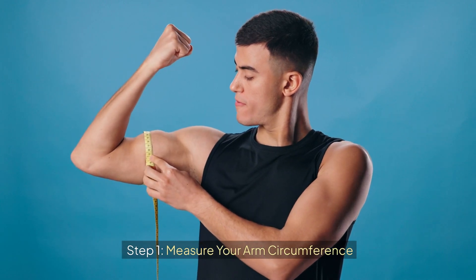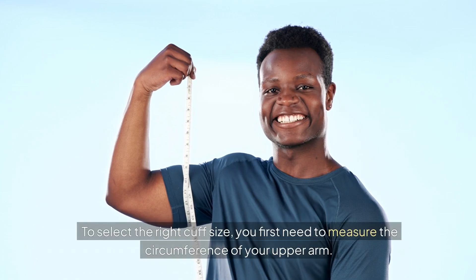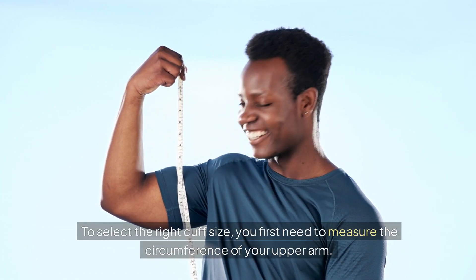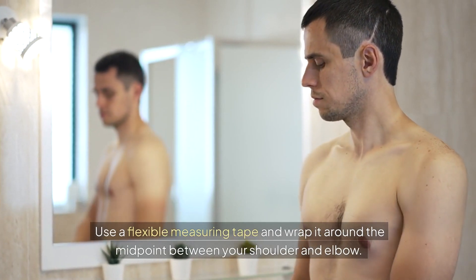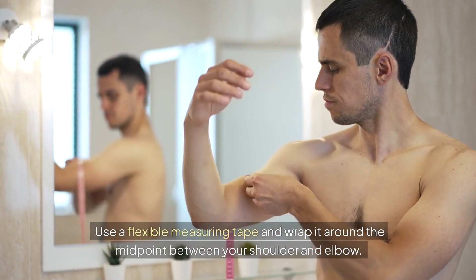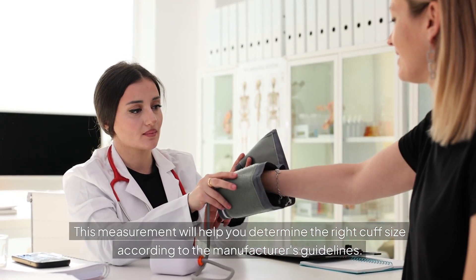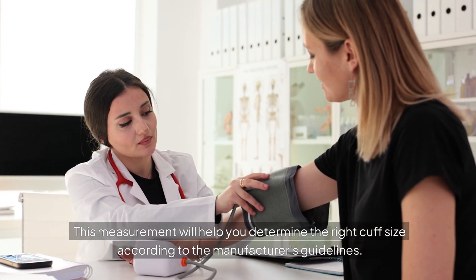Step 1: Measure your arm circumference. To select the right cuff size, you first need to measure the circumference of your upper arm. Use a flexible measuring tape and wrap it around the midpoint between your shoulder and elbow. Make sure the tape is snug but not too tight. This measurement will help you determine the right cuff size according to the manufacturer's guidelines.